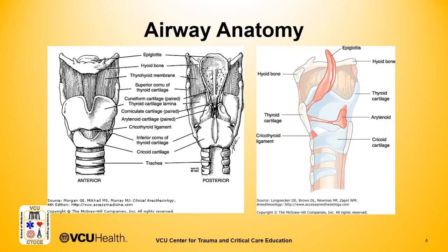The cricothyroidotomy is performed through the cricothyroid membrane. The cricothyroid membrane is located between the thyroid cartilage and the cricoid cartilage. When you palpate the neck, you can feel the thyroid cartilage and the cricoid cartilage. These 2 cartilages create a scaffolding to hold up the cricothyroid membrane and make this a very anterior site for the surgical airway. The scaffolding of these cartilages creates a foundation to allow you to palpate these anatomic sites, and it also allows the area not to collapse.